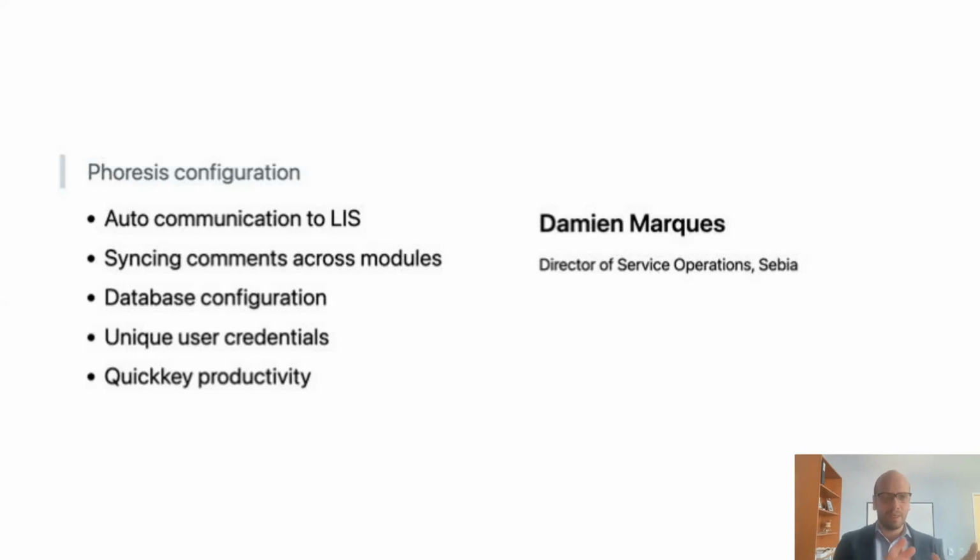So if we're viewing an attached immunofixation in the SPEP workflow and change the interpretation, when we log into the other module where we can validate immunofixation, those changes are consistent and persist. And this was really important to prevent confusion and dyssynchrony between those interpretations. He helped us configure our database such that we could be in charge of our own user credentials.